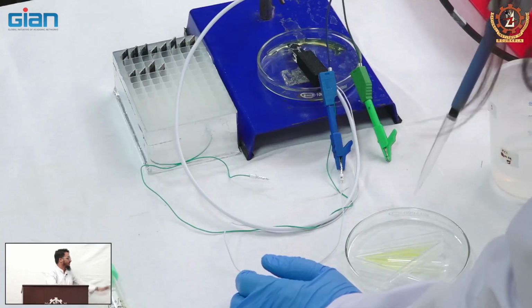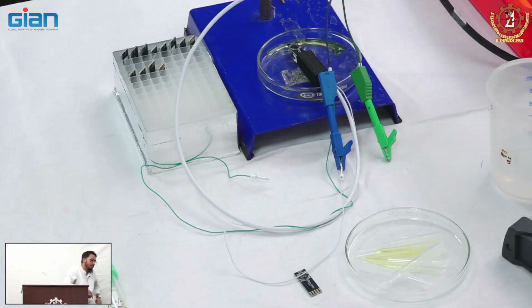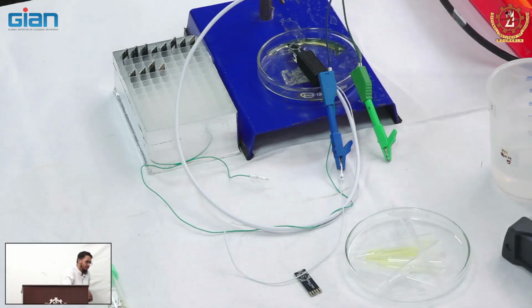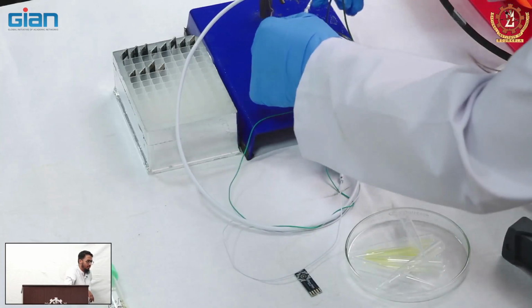Kaushik, can we please switch to the screen, this one? Okay. Experiment. Are you cleaning? Okay, so cleaning is being done. So you can wash it with DI water also before, if you wish. It will be better to wash with DI water and then put the known concentrations of glucose.